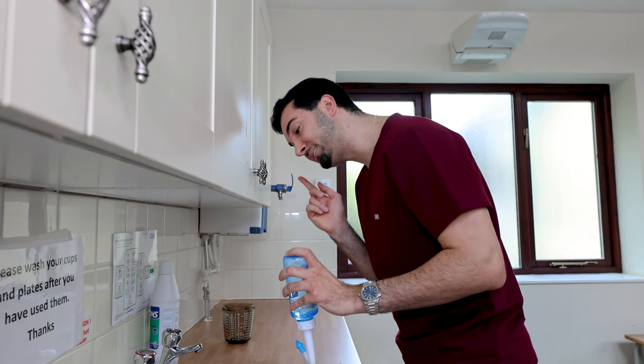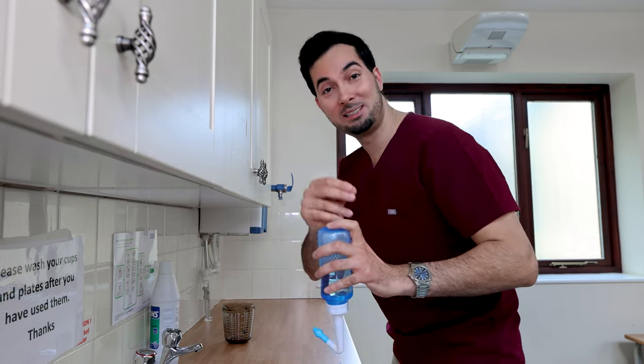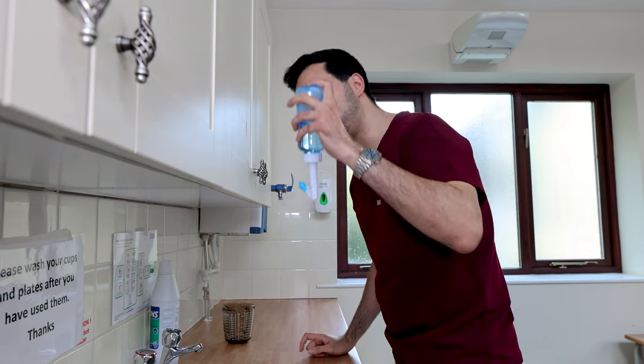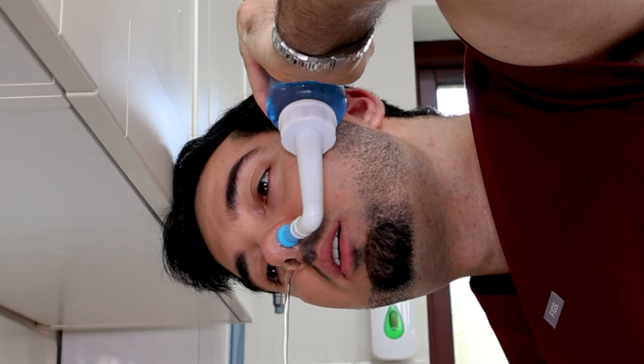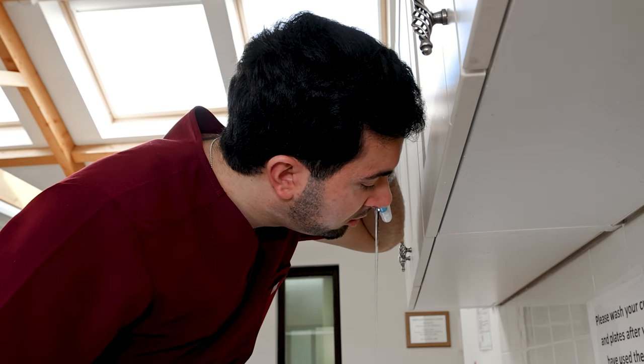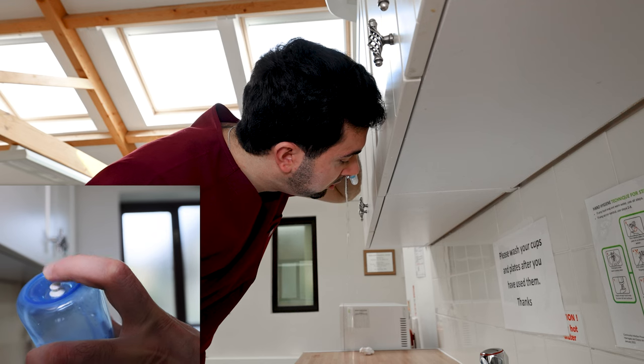For the left nostril, repeat step three. The only difference is you hold the device in your left hand this time, and you tilt your head forward to the right. Place the device firmly in your left nostril, breathe through your mouth, and press and hold the valve to initiate flow. The saline solution will flow through your nasal passage and out of your right nostril. Use the remaining solution, then release the valve to stop.